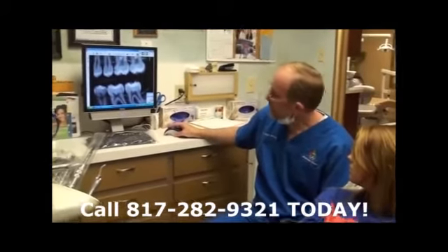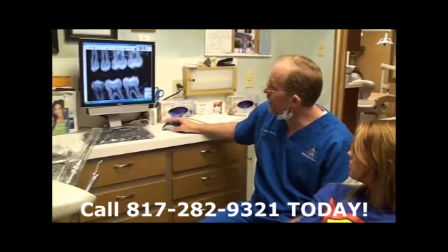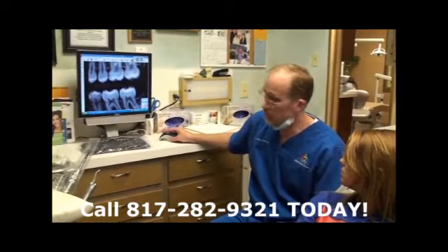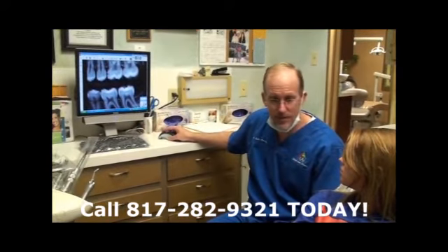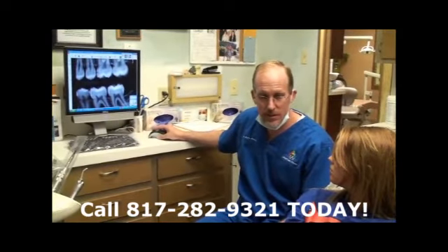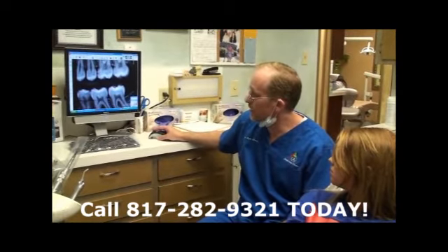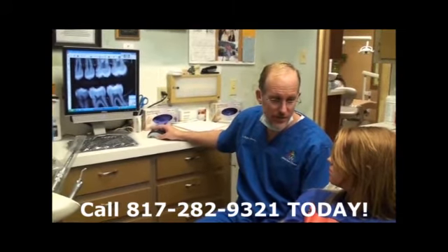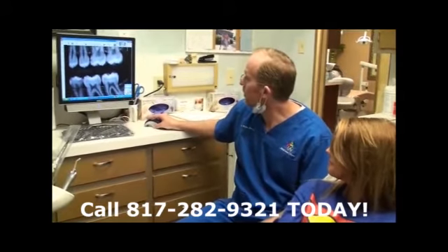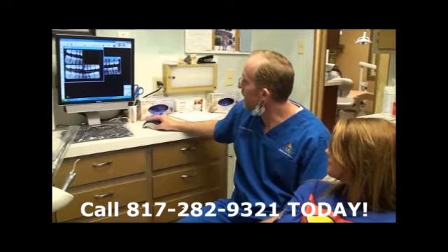Now the good news is that it's not very big. A lot of times when people get big cavities, they go all the way to this dark area in the middle of the tooth, which is the nerve, and then that's when people start having sensitivity. Like if you're going, wow, my tooth is hurting to sugar, and it hurts when I drink cold things, or sometimes it just kind of aches. Well, that's an indication that that cavity is getting close to the nerve. But that's not you, so that's the good news. You feel good about that? I figured so. So that is on your upper left that we can see that you have a cavity right there.